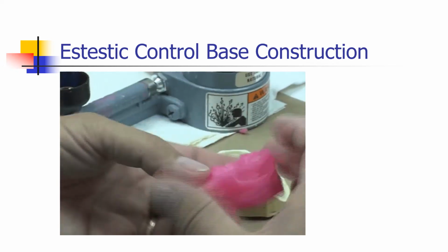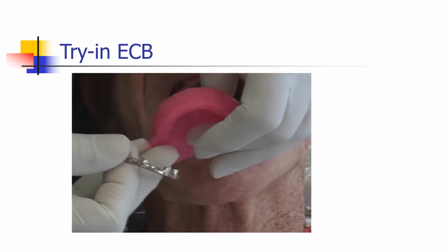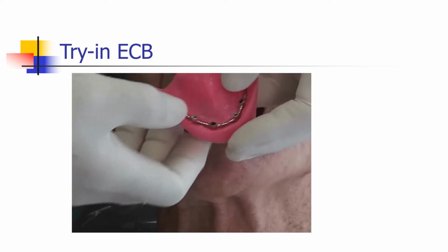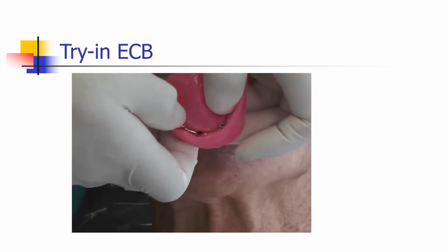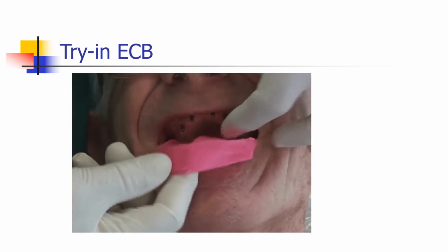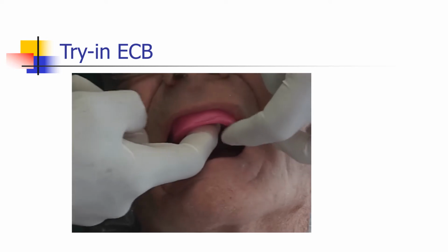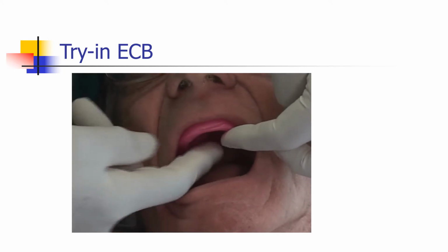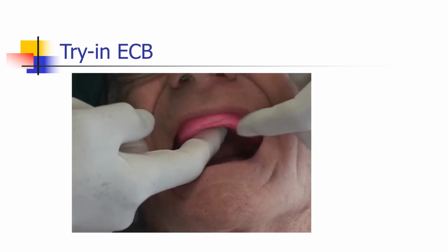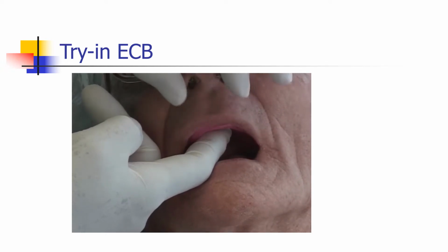Now we're ready to try the esthetic control base into the mouth. First of all, we place the bar back into the esthetic control base, and then place this into the mouth. You can see the mark from the compass here marking the lower lip line. Now what we're going to have him do is just relax the lip again and see if we're right there.